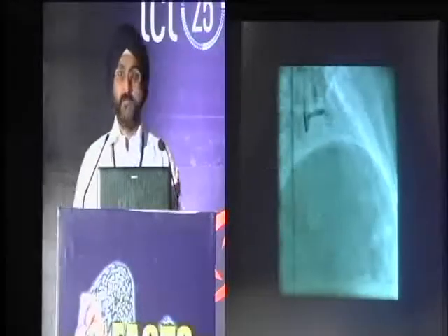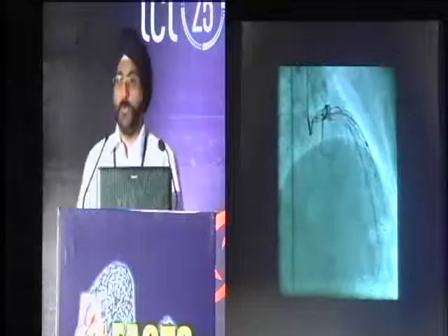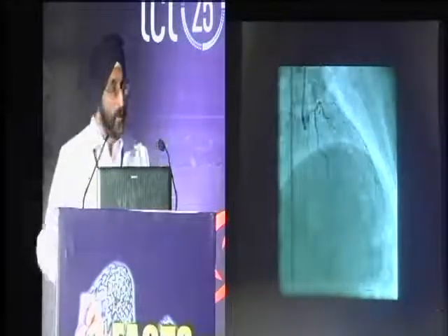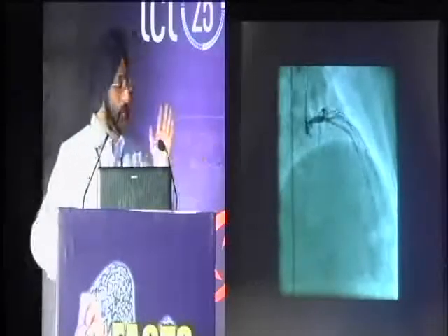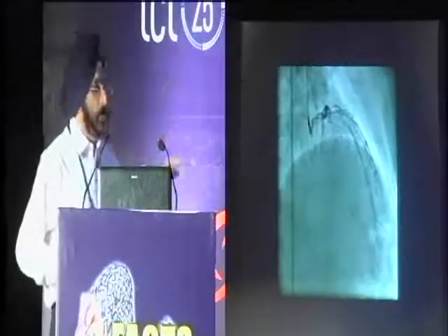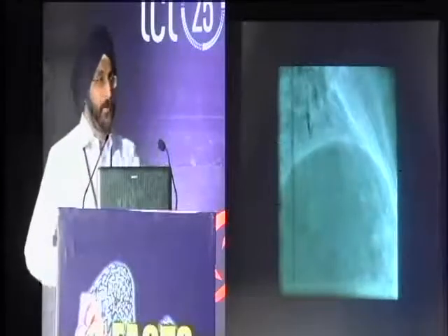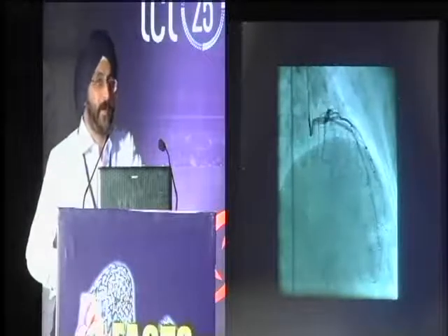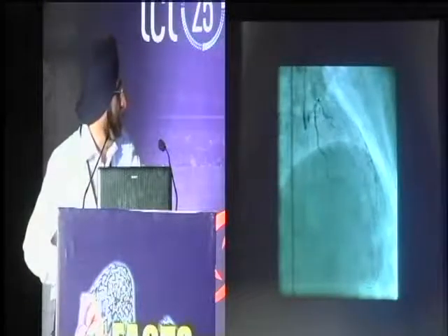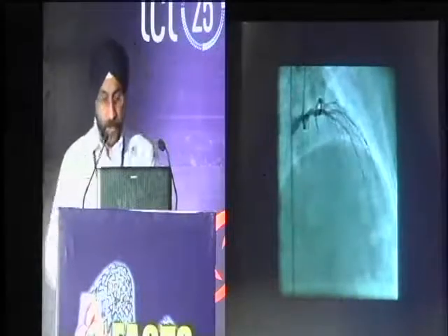Perhaps if I had not inflated the balloon first and had not created this mess, I would have taken another wire and tried to make a poor man's cutting balloon. But at this stage, yes, we have to have a controlled aggression. So we quit at this time, and the patient did settle down, pain definitely settled down, with the thought that we'll take up this case later on with some sort of ablation or shaving of a calcific spur, and do the case later on.